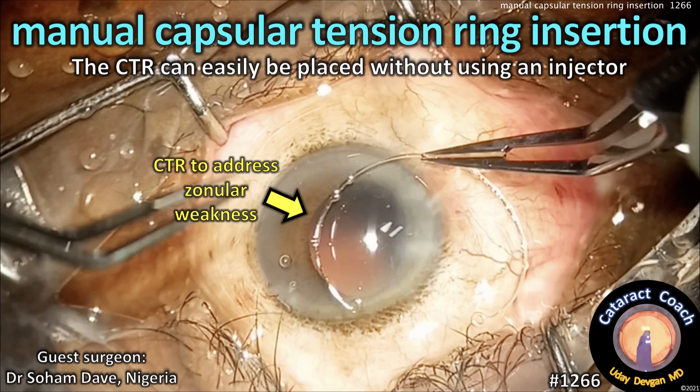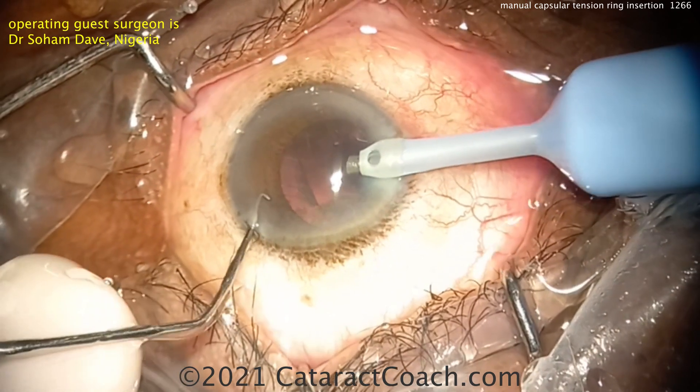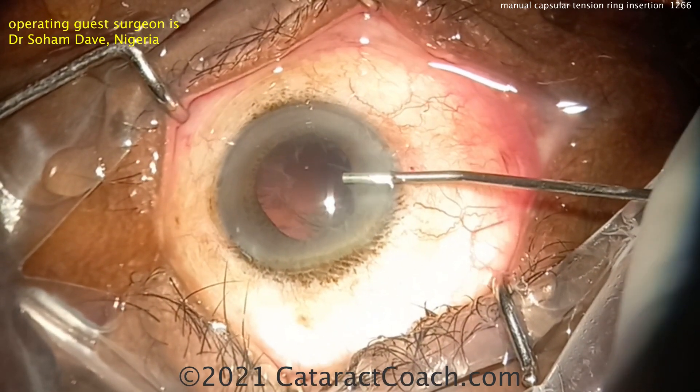CataractCoach.com — manual capsular tension ring insertion. You can place a CTR without using an injector. Our operating guest surgeon is Dr. Soham Dave from Nigeria. Here's the case at the end of nucleus removal, which went fine.